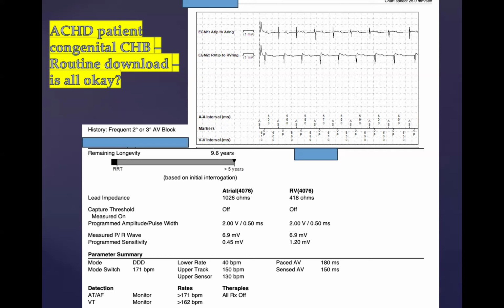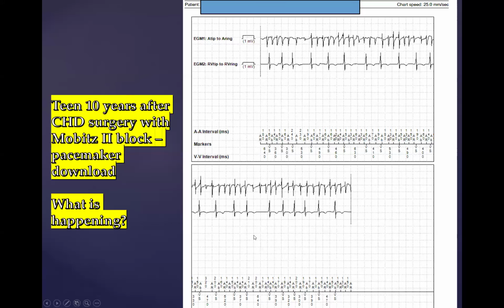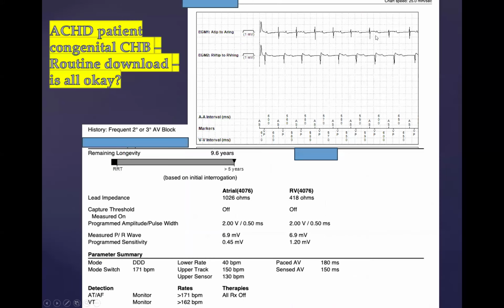lead, in the appendage. And the atrial appendage naturally lies sort of over the atrium, and the tip of the appendage can even be hanging over the RV outflow tract if you look at the outside surface of a heart. And so it's not uncommon that there's a little far field ventricular electrogram on the atrial lead. So this is an A, and this is actually a small far field V, which you see is sort of in time with the ventricular electrogram.